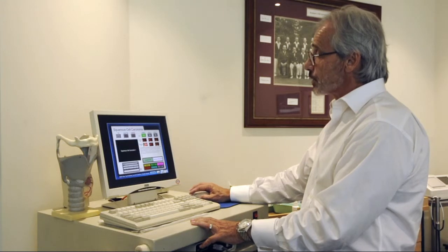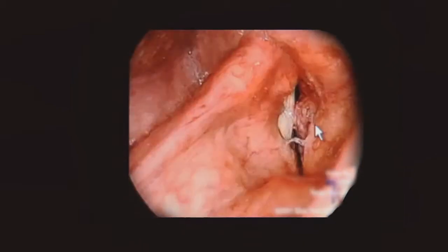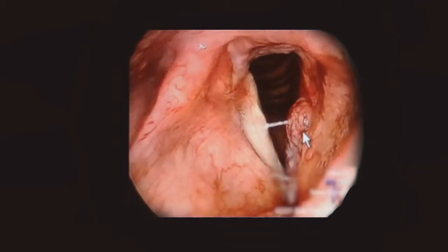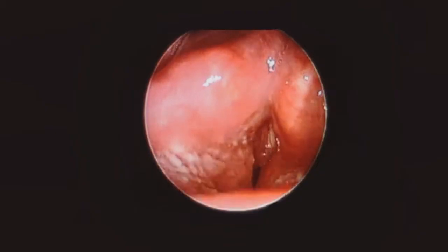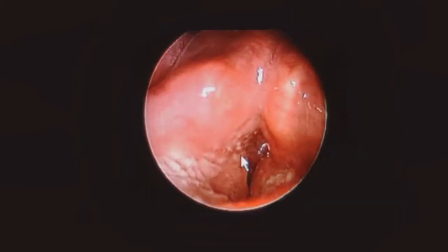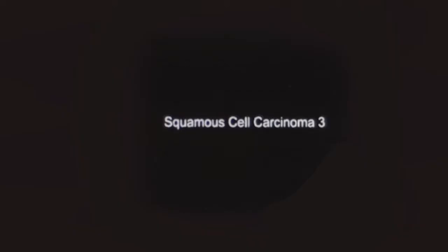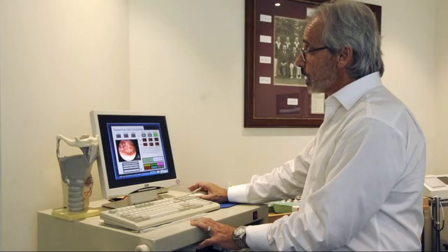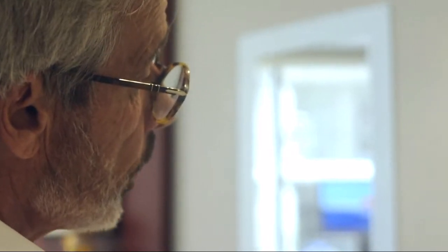Squamous cell carcinoma of the larynx is still the most common cancer. Here we see a large, bulky cancer on the left vocal fold; this particular cancer was treated by per-oral laser vaporization without the need for adjuvant therapy. In patient two, there is a larger cancer involving the false vocal cords and the epiglottis — this patient required a total laryngectomy. And in patient three, we demonstrate another area of localised cancer in the left vocal fold; there was involvement of the paraglottic space, so this patient was treated with external beam radiotherapy.